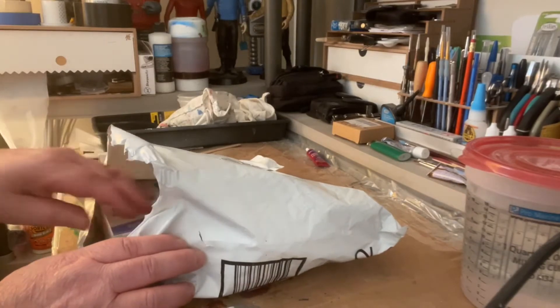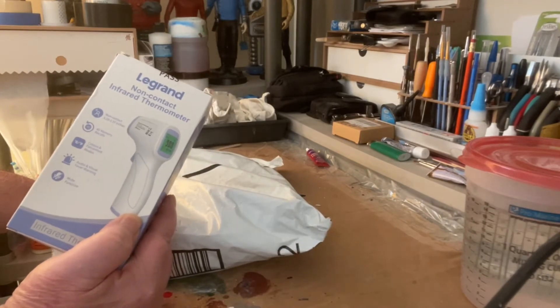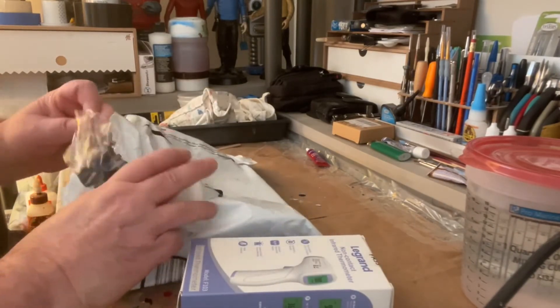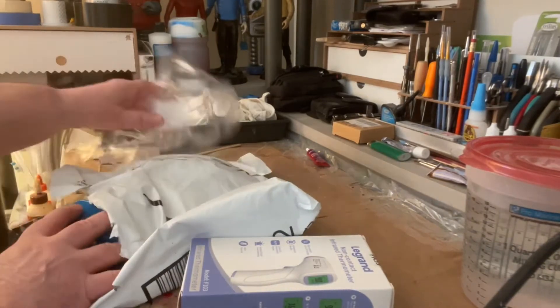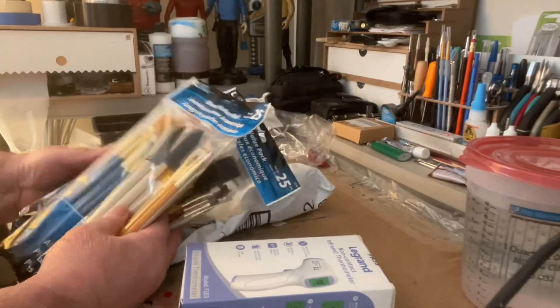We got some things in this package. We've especially got this thermal infrared thermometer, and we're going to go over that. We've also got a package of brushes here. Got a lot of brushes — they sent me two, they sent me three.